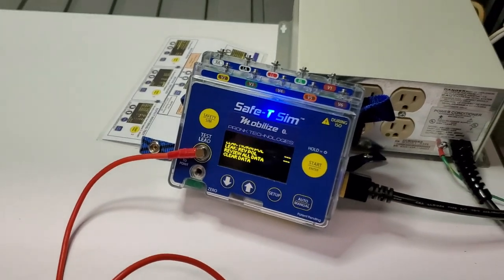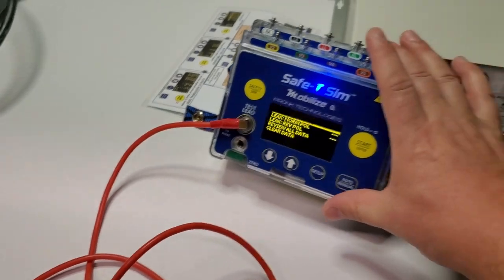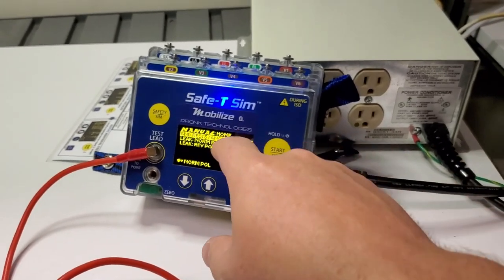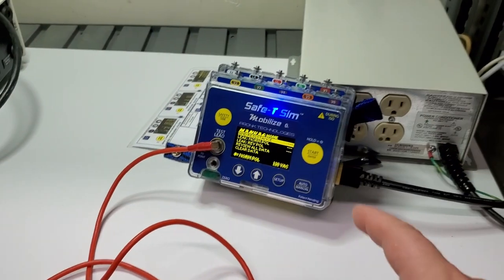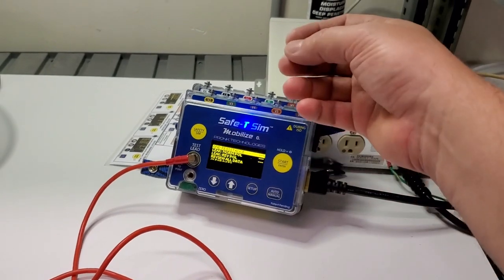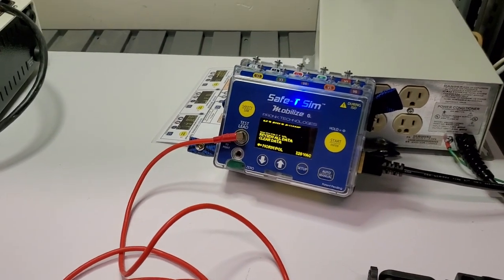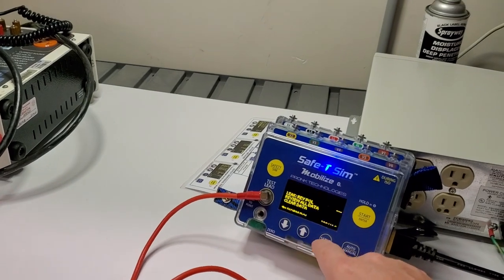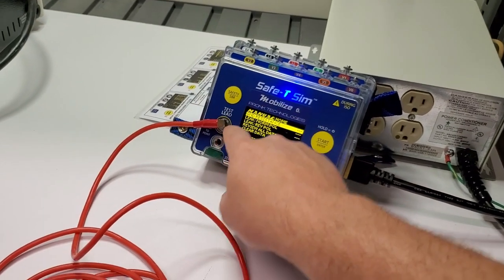It's a very compact unit — you can see based on the size of my hand it's only about four and a half by six inches, so very small but it's got a lot of features. The display is a vibrant light-on-dark LCD that looks really nice. The controls are pretty simple: there's a Safety Sim button, down, up, setup, auto/manual, and a start/enter button.